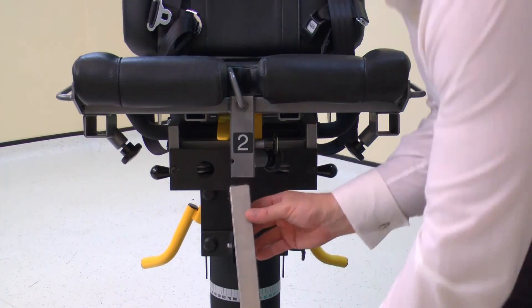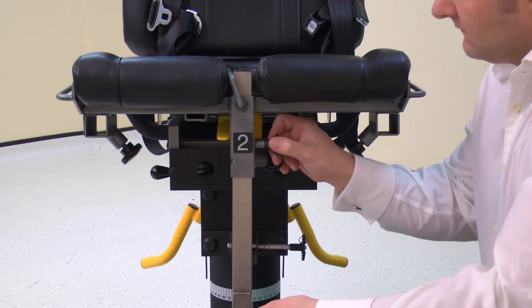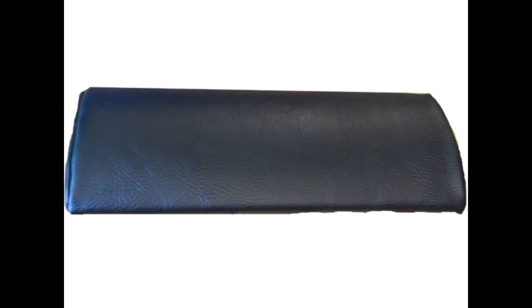Next, install the footrest into the chair using tube number 2. Pull the locking pin to allow full installation. Secure with the locking screw. Place the pillow on the chair if required.